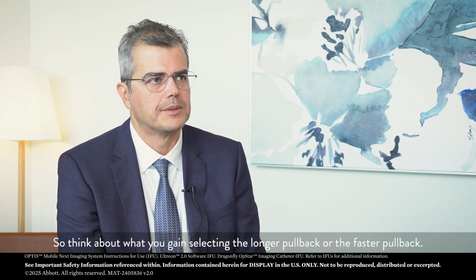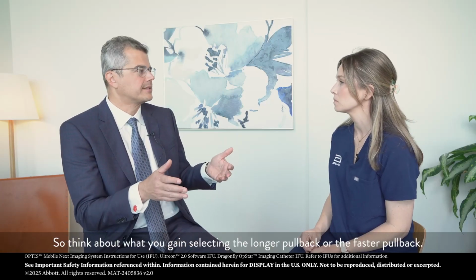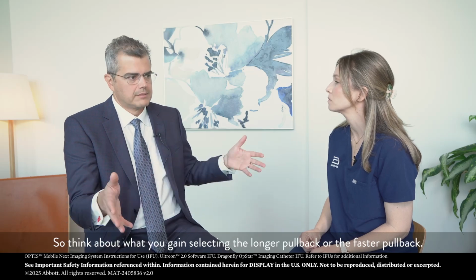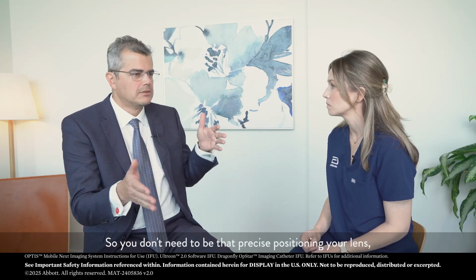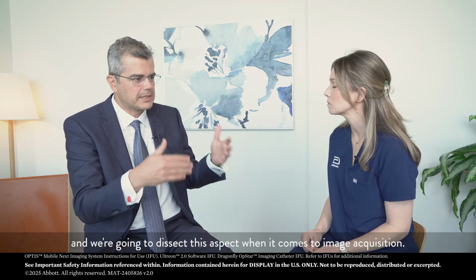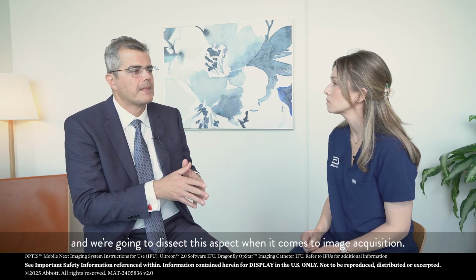So think about what you gain selecting the longer pullback or the faster pullback. Obviously you gain longer scan, so you don't need to be that precise positioning your lens, and we're going to dissect this aspect when it comes to image acquisition.